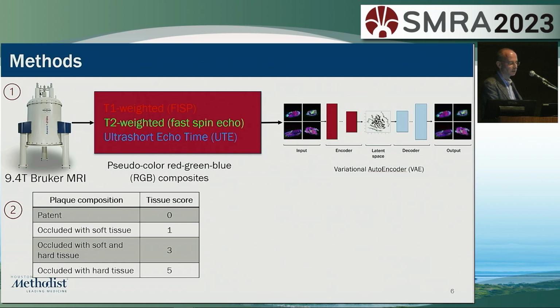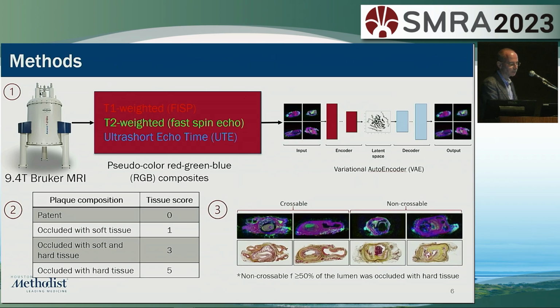So the interesting idea here is, again, to condense the image information, again, for a particular application, into a numerical value, into a score. And, well, luckily, right, we do have histology. So histology here, and that's shown down there in the third step, these are actually images that are reconstructed, or the output of the algorithm, and see, I mean, is it actually usable?